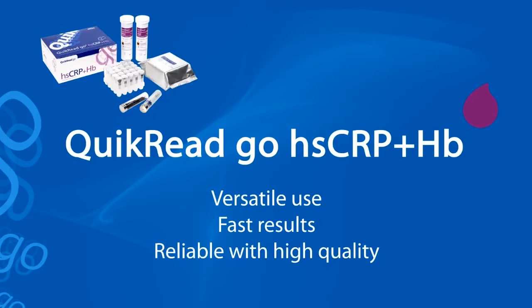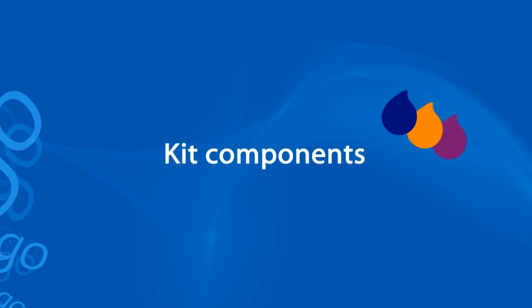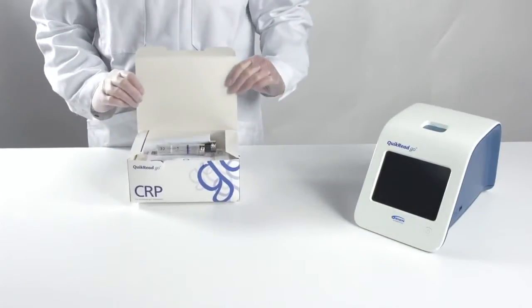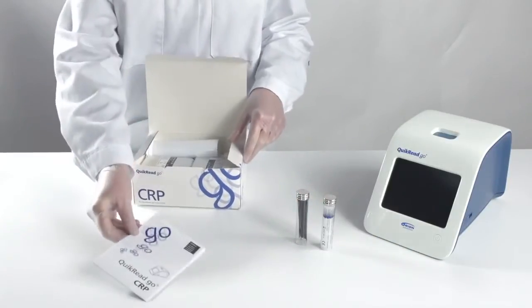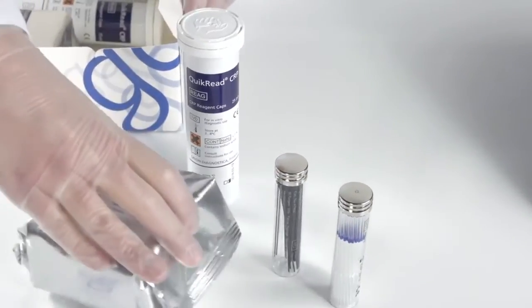The HSCRP plus HB test gives simultaneously also the hemoglobin result from the same whole blood sample. The ready-to-use kits contain all the needed components for performing the tests. Each kit contains plungers and capillaries for sampling, instructions for use, two tubes of reagent caps and two foil-covered cuvette racks.